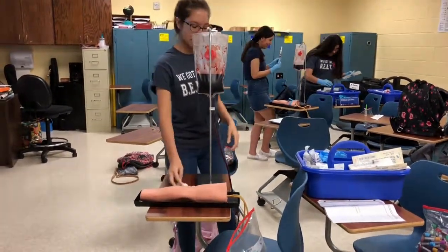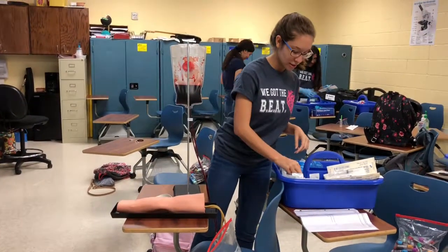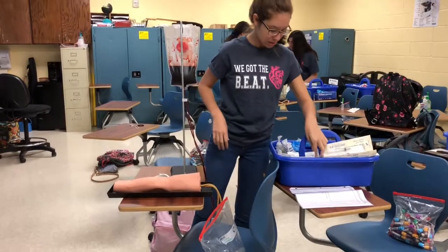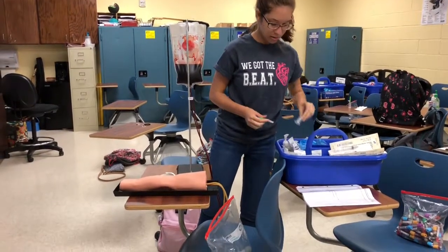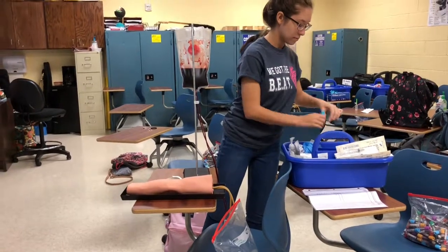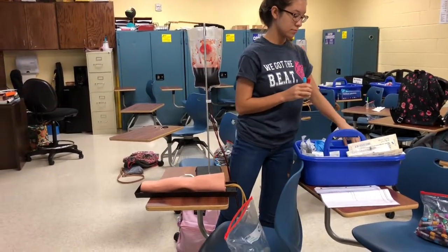Next, I will be gathering my supplies. I grab a tourniquet, a band-aid, an alcohol wipe, a gauze pad, my needle, and my gloves. I also will be using my vacutainer tubes to hold the blood. I grab a blue, a red, and a yellow tube.